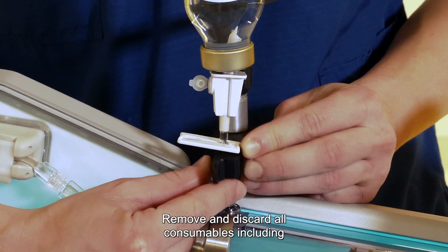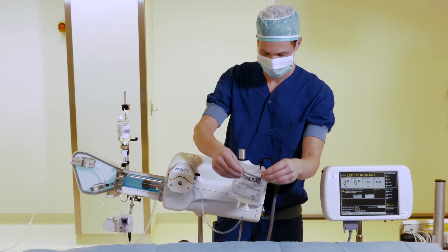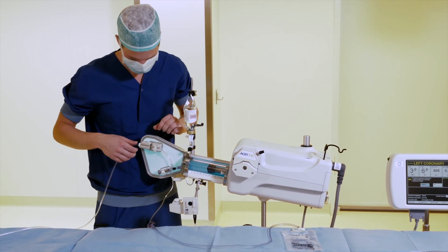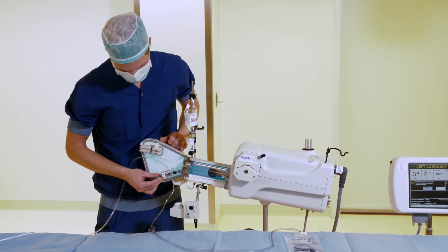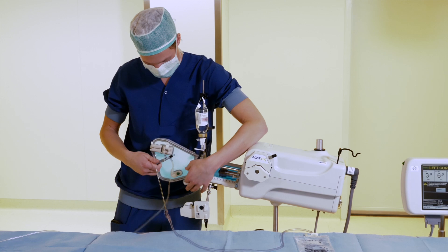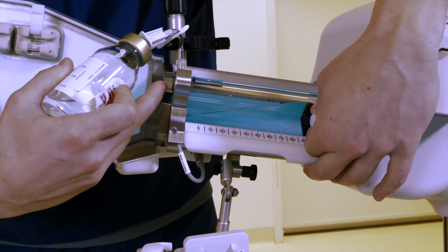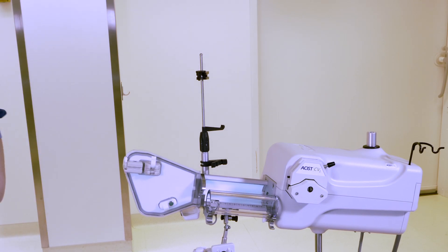Open the syringe chamber. Remove and discard all consumables, including the contrast syringe, saline bag, hand controller, patient tubing, and manifold assembly. Then close the syringe chamber.